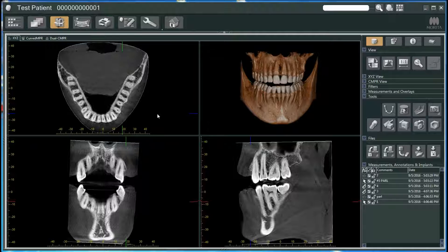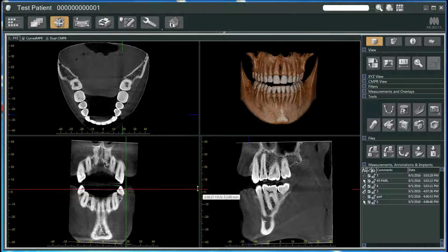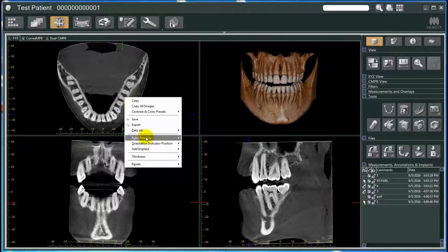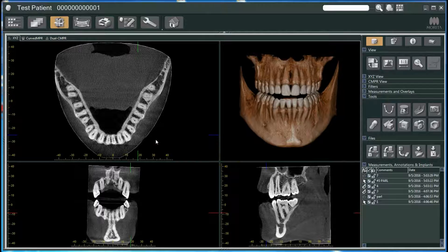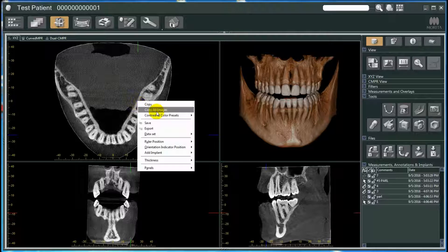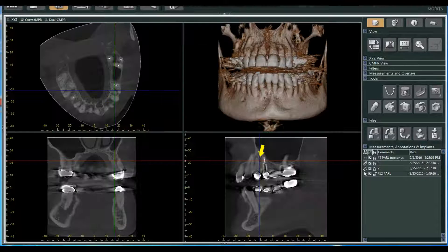One thing I didn't show — you can right-click on these images and adjust the thickness. Right now we're viewing in a one millimeter slice, but you can take it down smaller. I'll change it if I'm doing endo work — you can change it to 500 microns and view it a bit differently. You get a little bit of graininess and noise in the image when you take it down smaller. You can go down to 160 micron slice thickness.